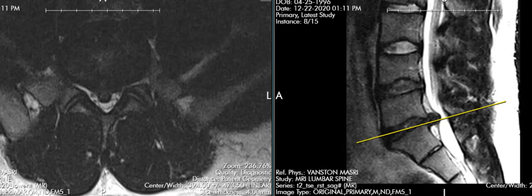But really, the fact that his disc herniation is very centrally oriented and is very large, that disc could be removed from a posterior microdiscectomy approach, but it's probably not the best way to get it out. Additionally, a lot of his pain is back pain or disc related. So we're trying to tie together the imaging findings, the characteristics of his symptoms, in the setting of how the rest of his spine looks.